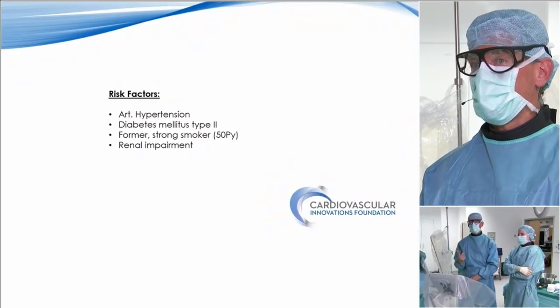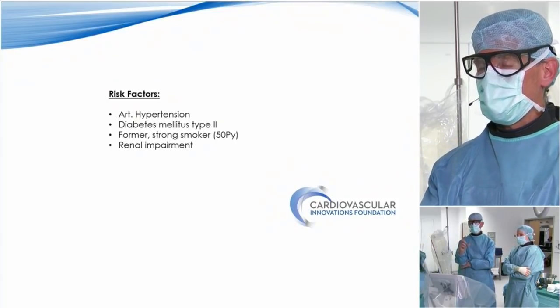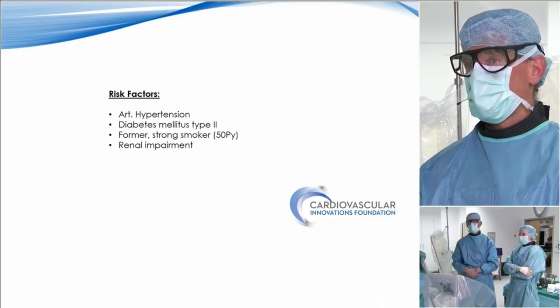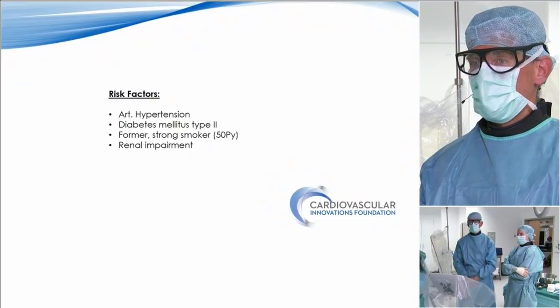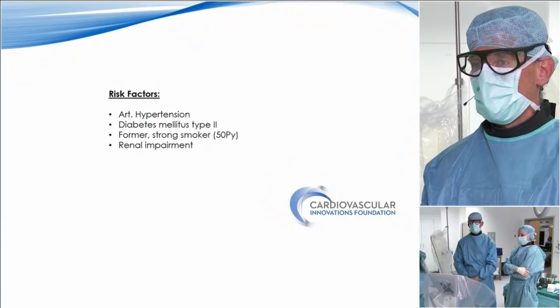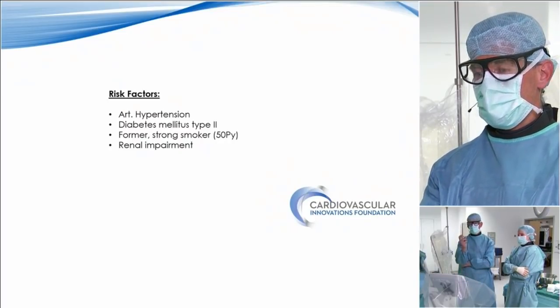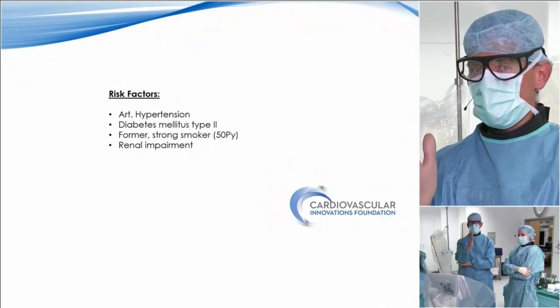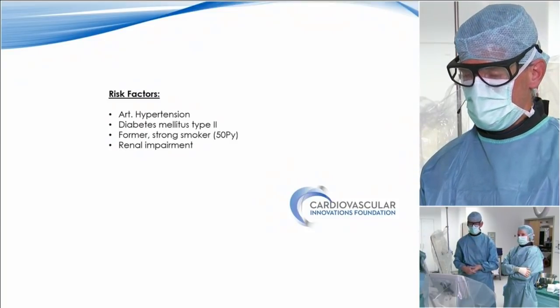Yeah, we have actually recanalized some of the cases where they have actually used the proximal 10 centimeters of the SFA as a patch to go to the profunda artery. So we had to connect through an area where there was actually no artery left anymore. And that was also successful, in fact, in all these cases. The 2 cases where we failed were actually those where they had quite some prosthetic graft at the profunda area, and when we poked to the profunda area the graft always jumped back because it was so soft.